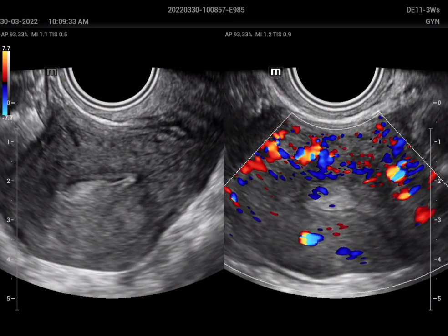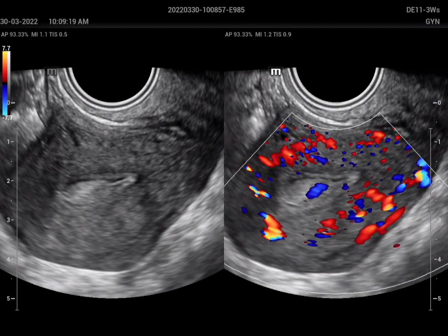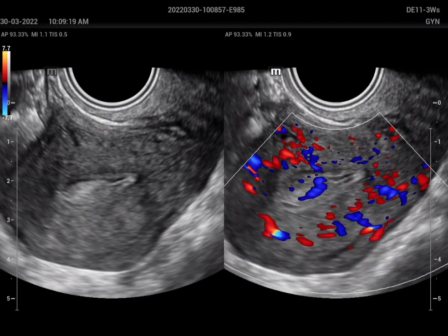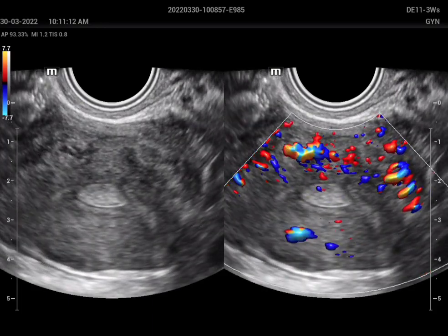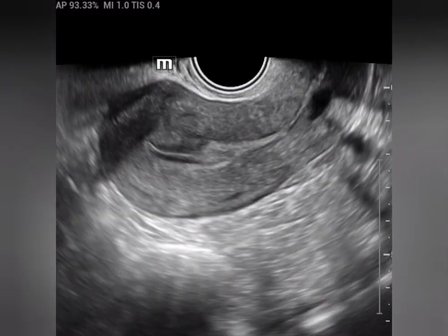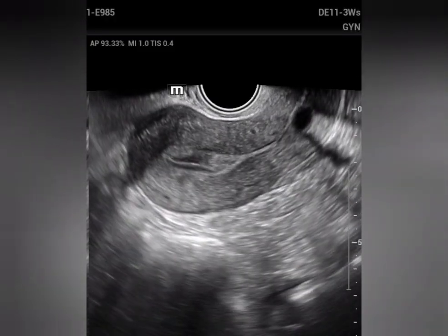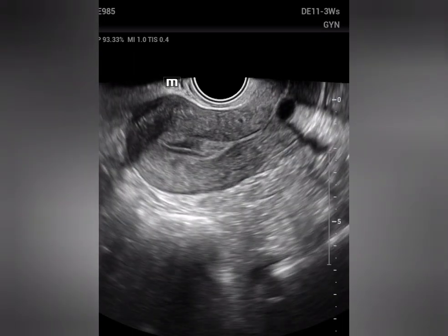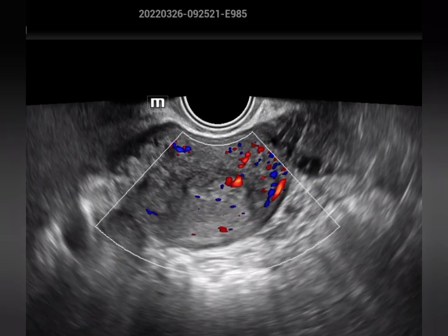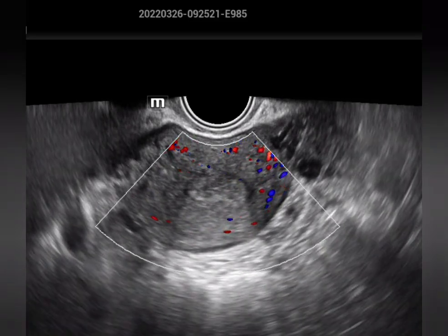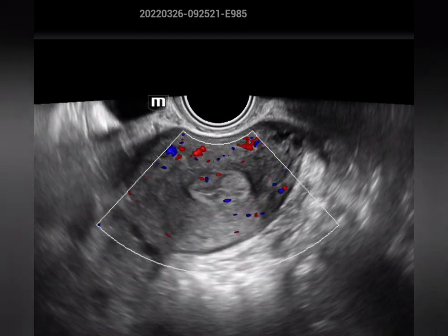Look at the transverse scan and the feeding vessel sign, and also in the longitudinal scan it is more clear. We also have a similar case but smaller — a hyperechoic lesion seen in the endometrium, and when we apply the color Doppler on the transverse scan you can see the feeding vessel sign.